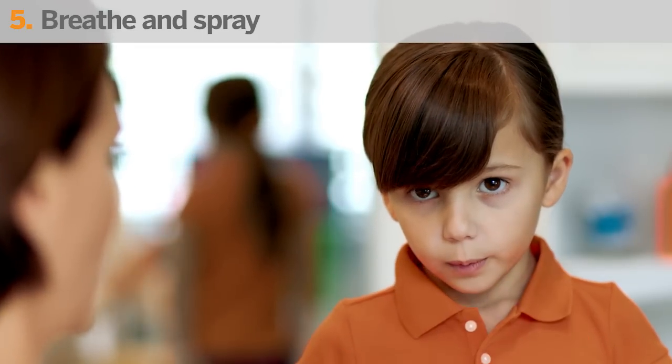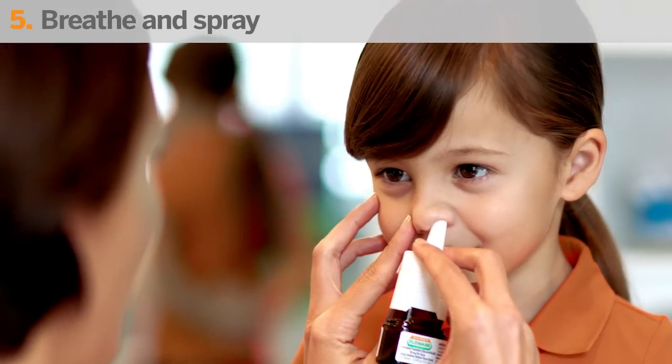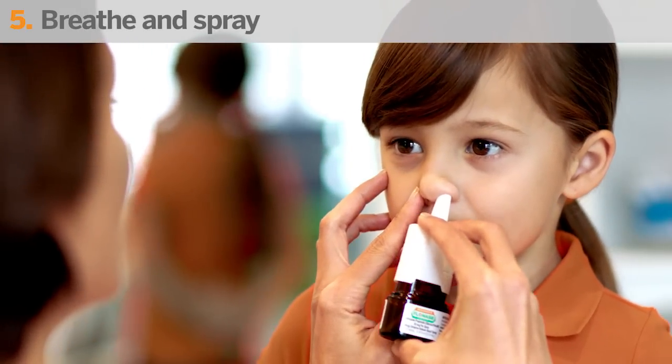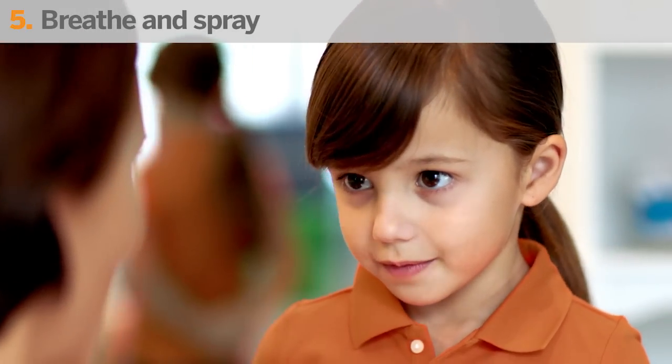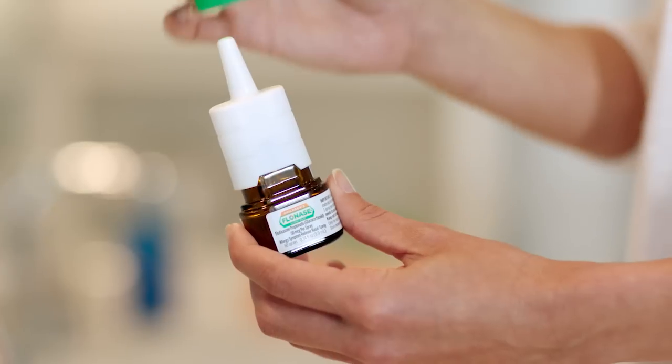Then have your child breathe out through their mouth. Now, repeat in the other nostril. Then wipe the spray nozzle with a clean tissue and replace the cap.